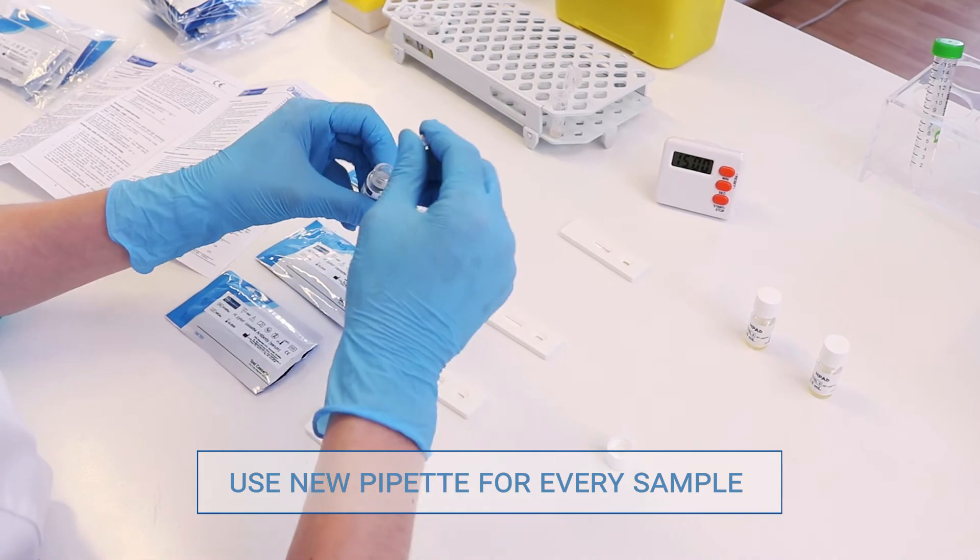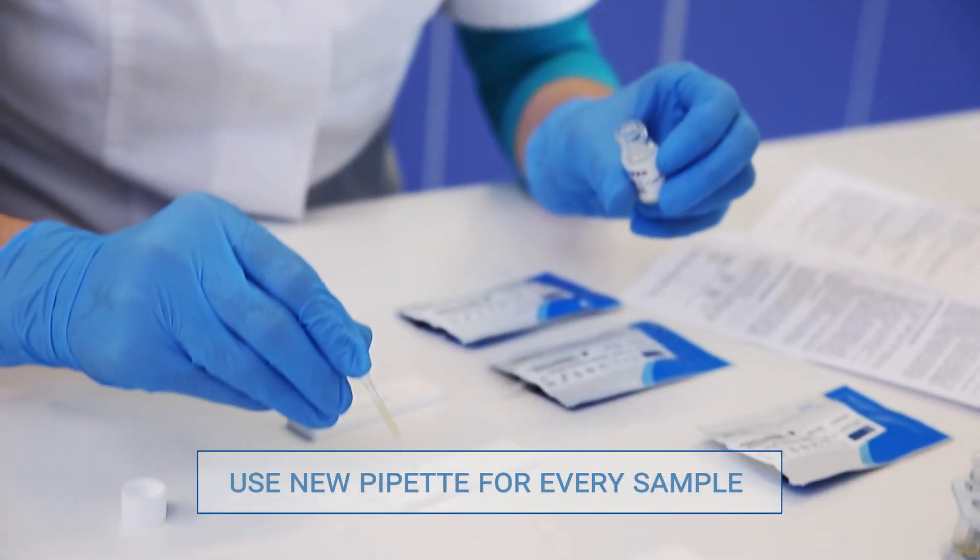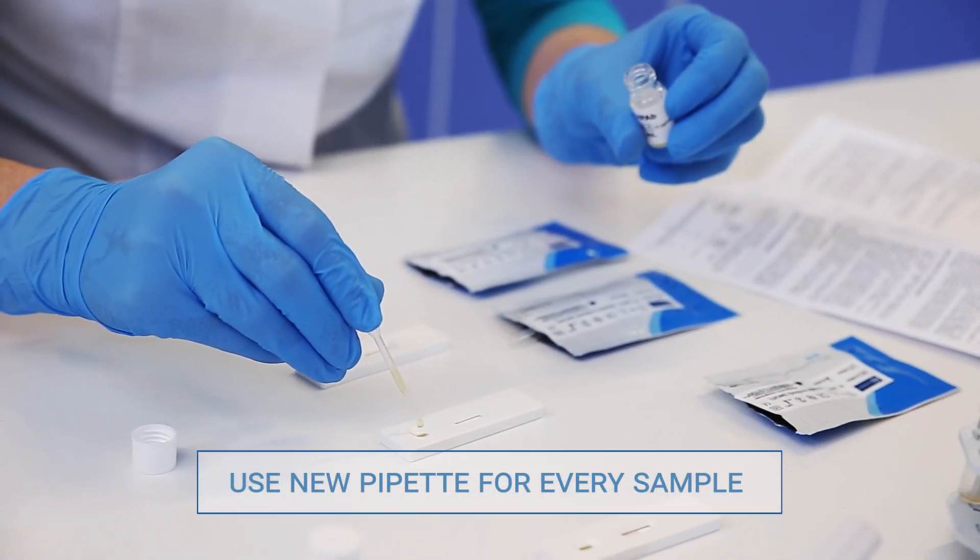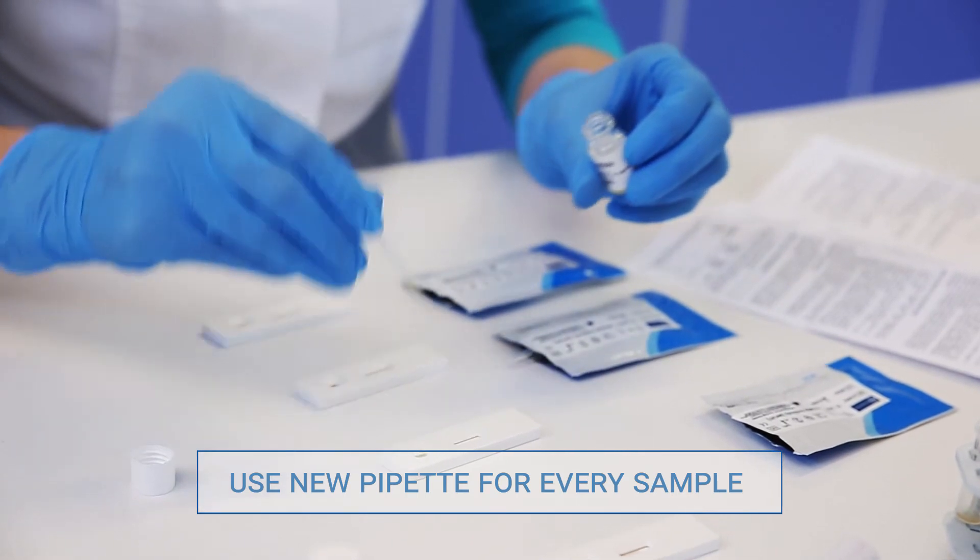With a pipette, add 2 drops of control serum with a 13 microgram per milliliter concentration into the sample well.